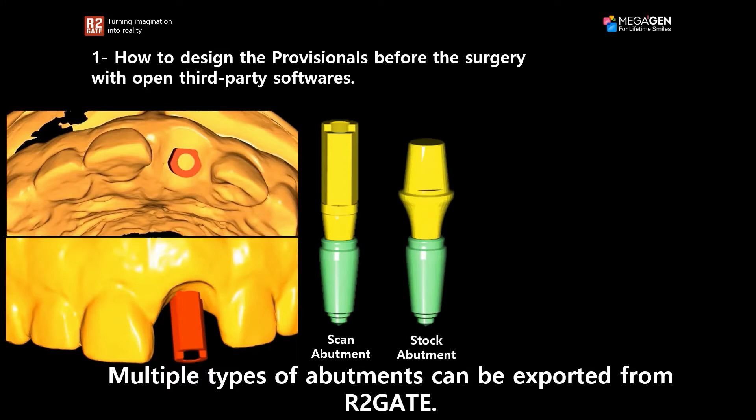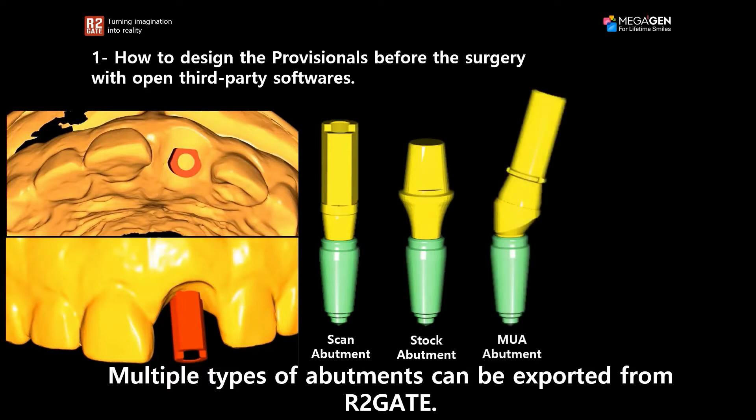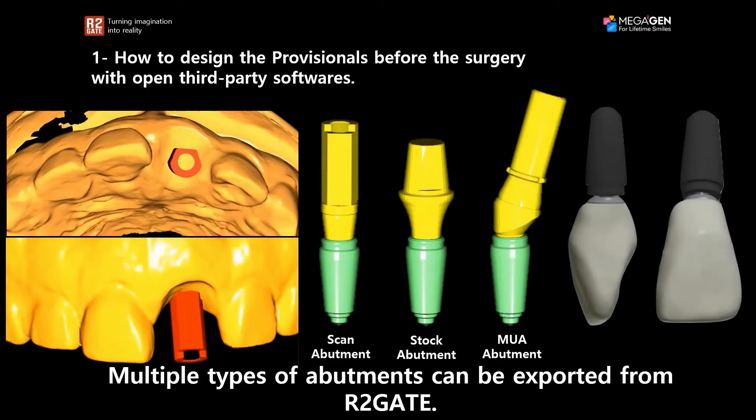You can also export a stock abutment from the R2GATE software, and you could also export a multi-unit abutment, and that allows you to design the prosthesis before the surgery.